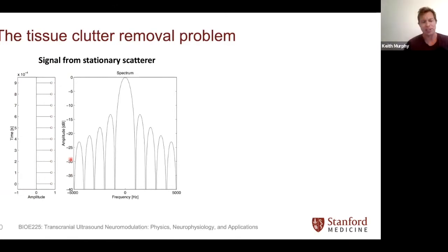Tommaso, you're saying the blood is also being replaced by more blood scatterers of the same sort of random distribution. So it'll always look the same when it's coming back. Is that right? Well, in this case, yes.